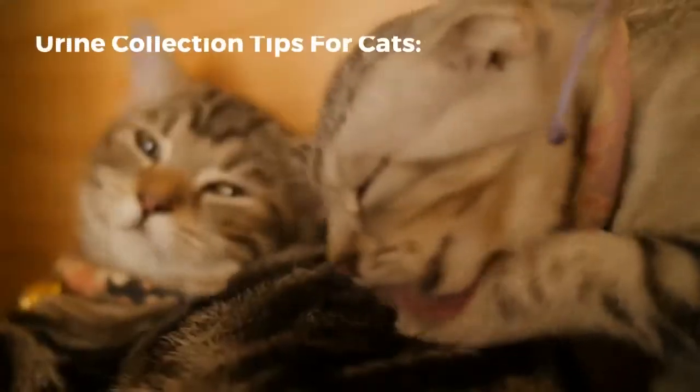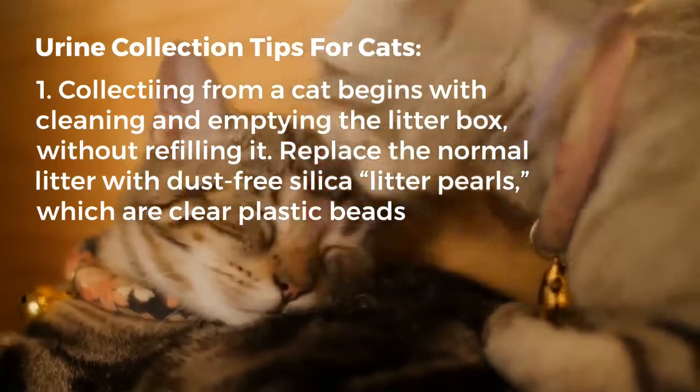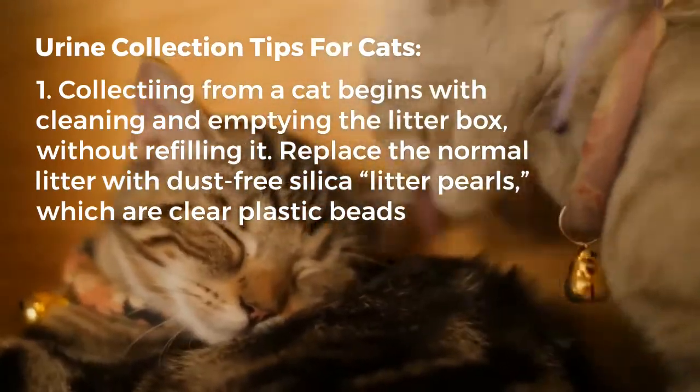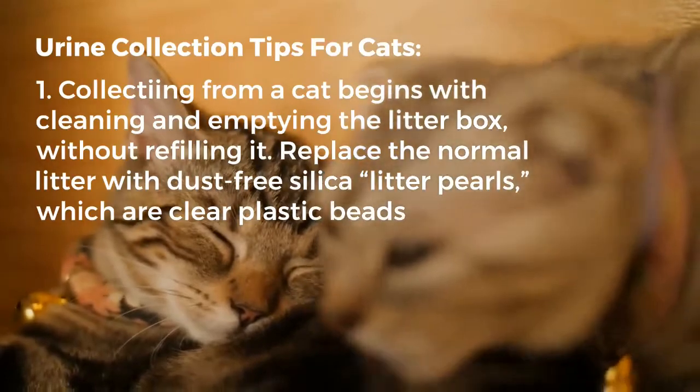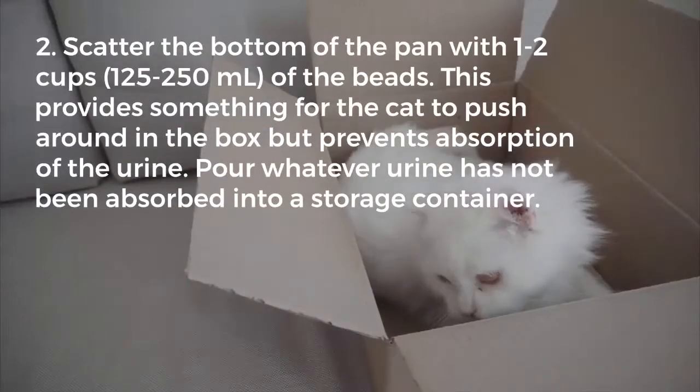Here are some tips in collecting urine from cats. First, collecting from a cat begins with cleaning and emptying the litter box without refilling it. Replace the normal litter with dust-free silica or litter pearls, which are clear plastic beads.